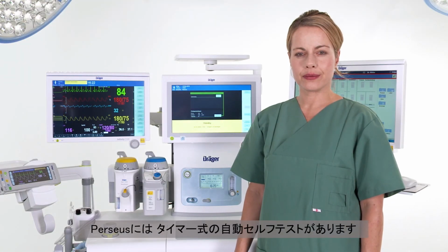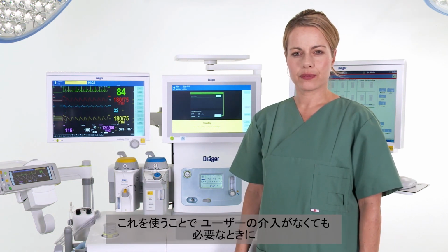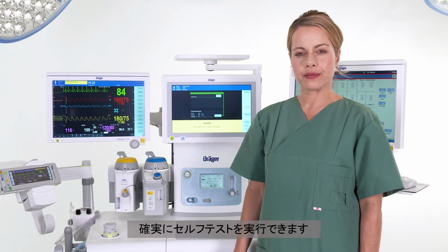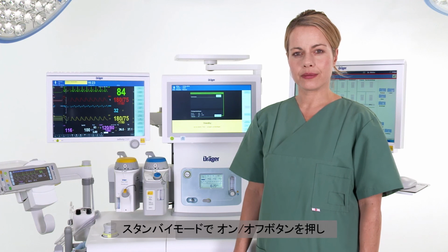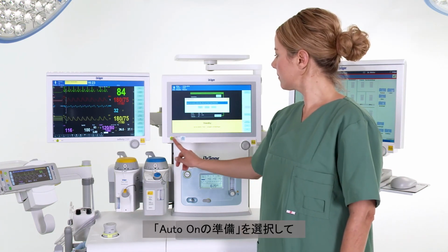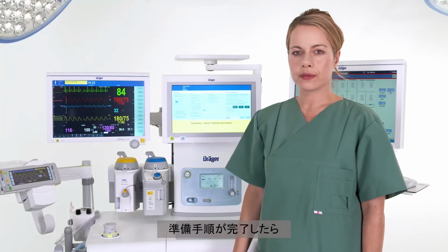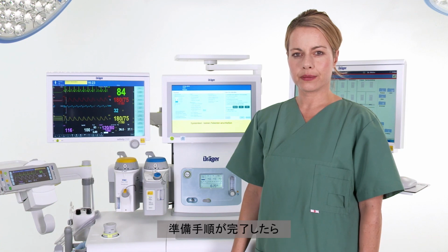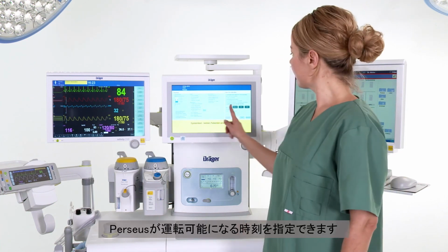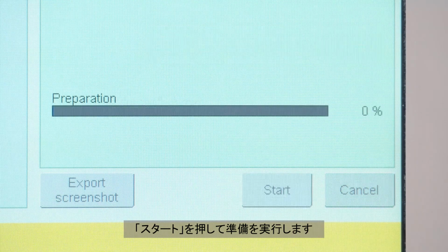The Perseus has a time-controlled automatic self-test. This ensures that the Perseus performs a self-test at the required time without any intervention by the user. In standby mode, press the On/Off button and select the option Prepare Auto On in order to prepare the automatic self-test. After completing the preparatory steps, you can specify the time you wish Perseus to be operational. Press Start to run the preparation.